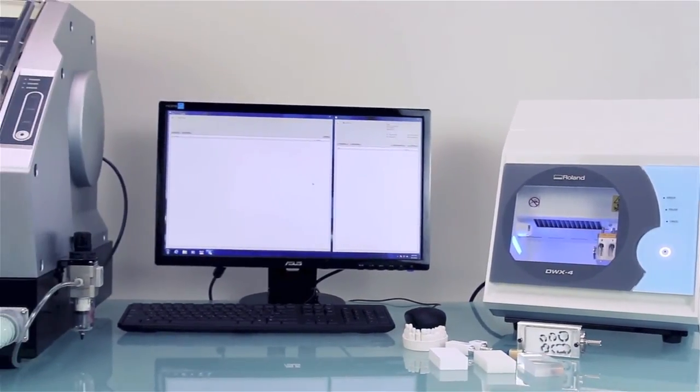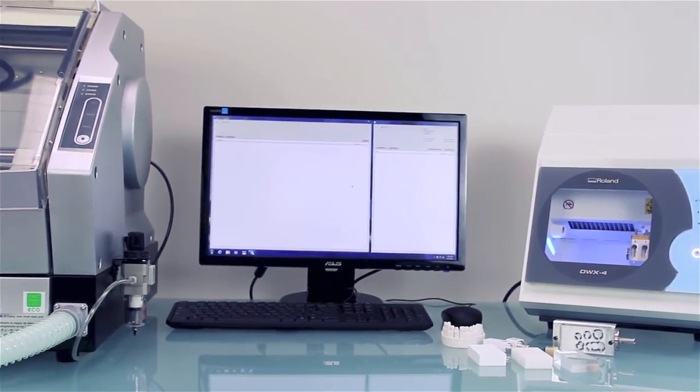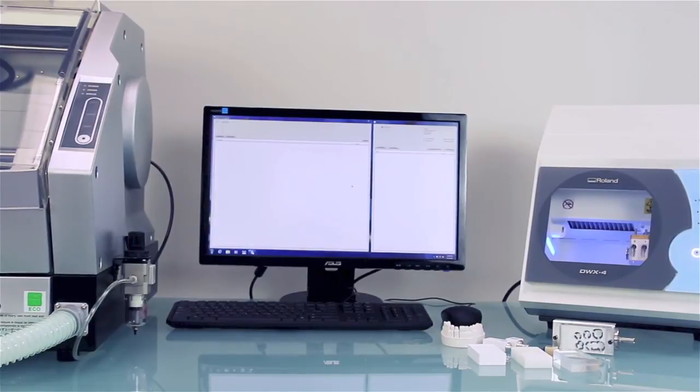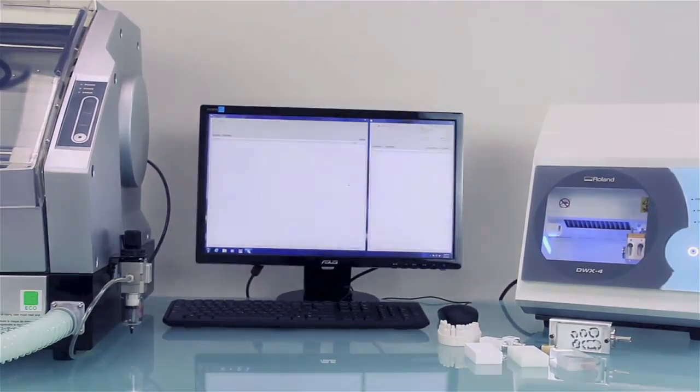When you're ready to grow, the DWX4 lets you operate up to four Roland milling machines from a single computer.